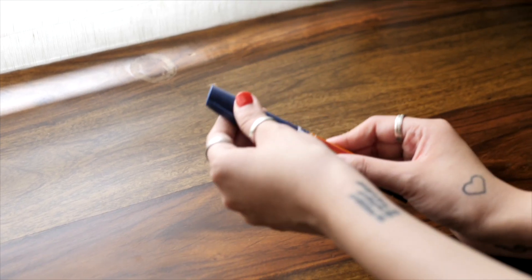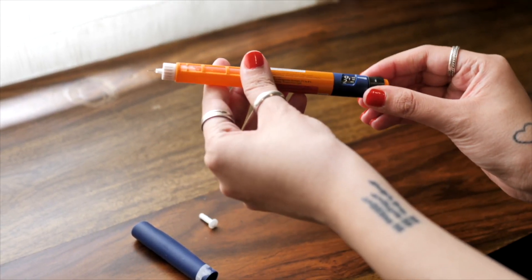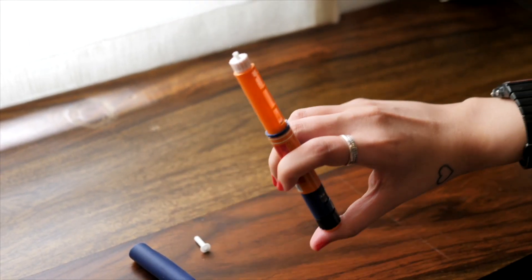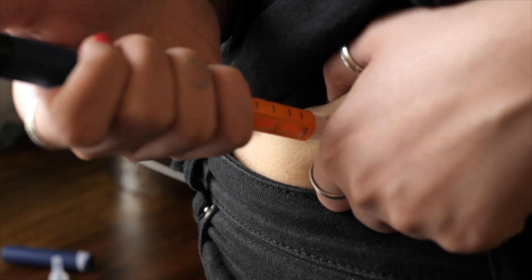It may seem like you're wasting a few units of insulin, but it's actually an investment. It's better to be sure that insulin is seamlessly flowing out rather than taking the chance of injecting air. Always prime your pen after every prick.